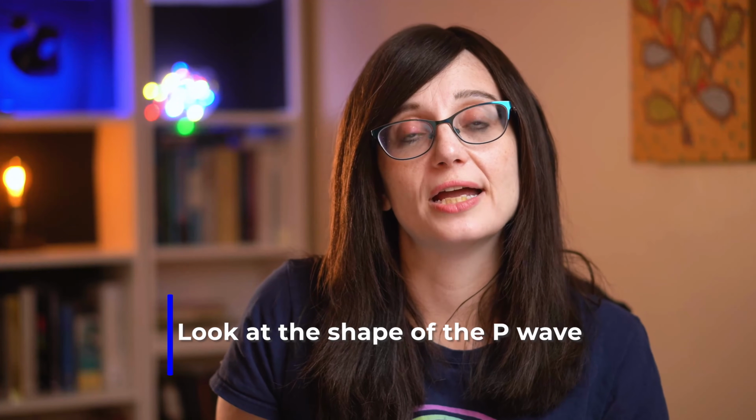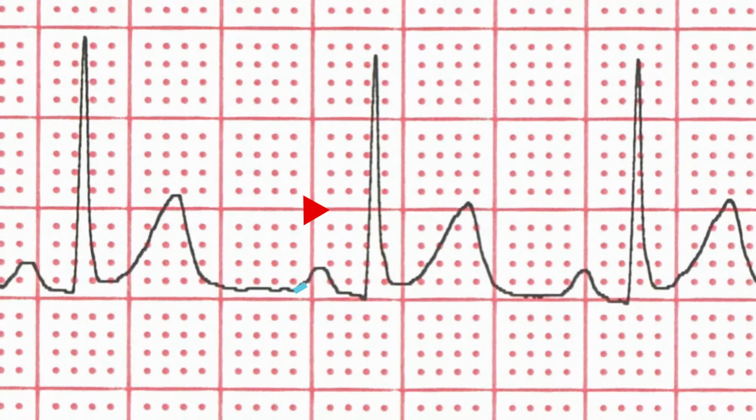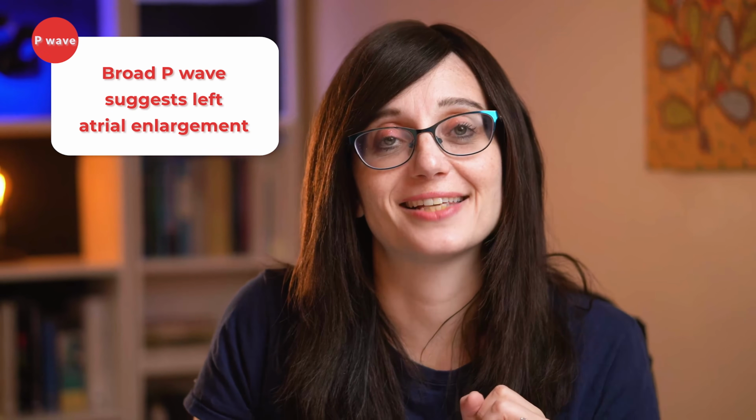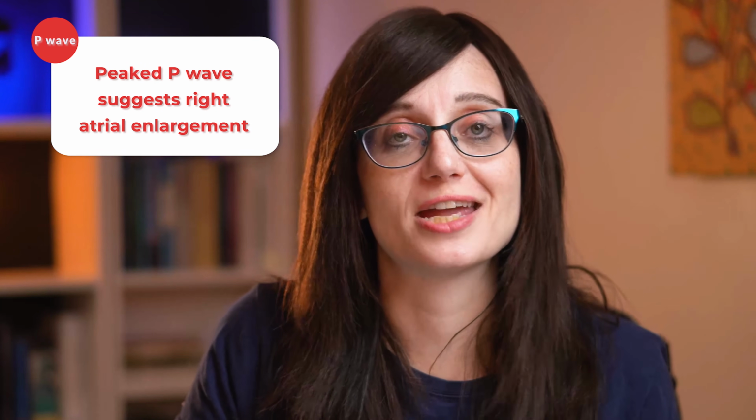Because what you want to know is that the current moves from the sinoatrial node away from it over a normal time period. If the P wave looks broad and it contains a notch, so it takes up a longer amount of time over the x-axis, that suggests left atrial enlargement. If it's peaked or spiky, then it means the voltage is high, and that suggests a right atrial enlargement.